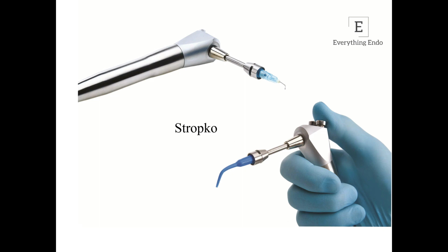Next is the Stropko. Stropko is nothing but an extension that can be attached to the conventional three-way syringe. The added advantage is that it has a locking mechanism so that when you blow air through your three-way syringe, these little tips that are attached to it will not fly off. Additionally, your local mechanic can add an extra attachment to the chair which can help reduce the pressure of air that comes through the Stropko, meaning you can boldly use it into the pulp chamber and also inside the canal without fear of emphysema or any other complication.